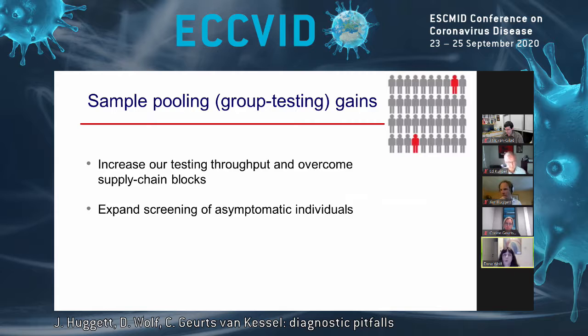And this brings me to sample pooling or group testing. And I will discuss some general aspects, but mainly tell you about our practical experience utilizing sample pooling to increase our testing throughput, to address these peculiar challenges, and particularly to expand screening of asymptomatic individuals.